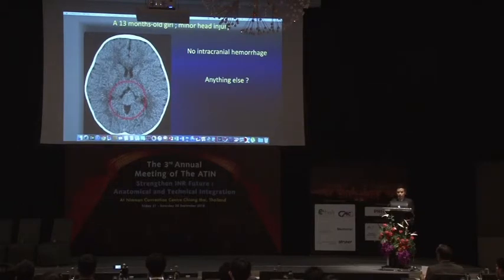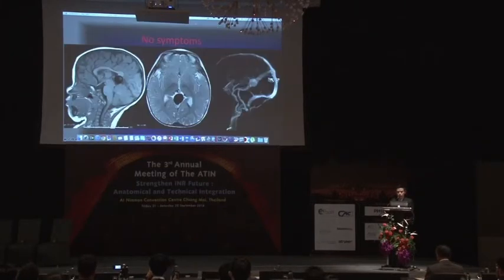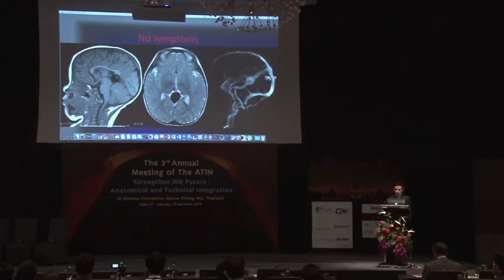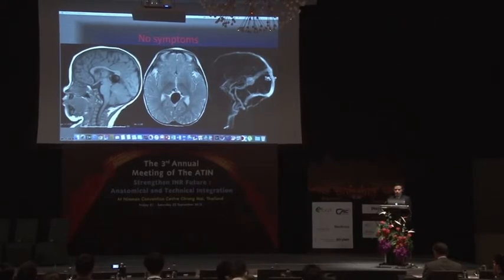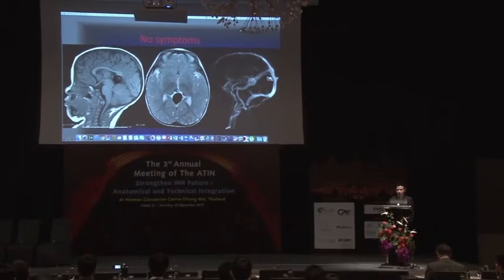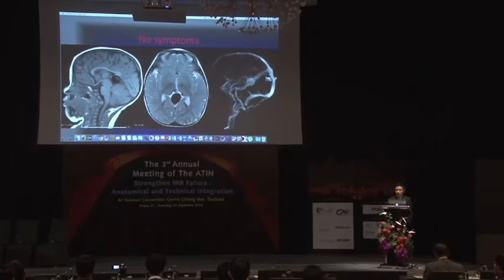You see this one, the abnormal dilatation of the vessels. In the MRI, you can see the enlarged median prosencephalic vein and the dilatation of the arteries, and you see the VGAM here and the straight sinus. For this case, no symptoms, we consider it an incidental VGAM.